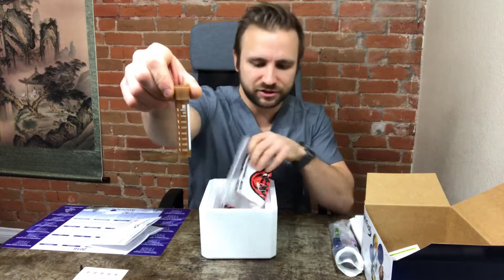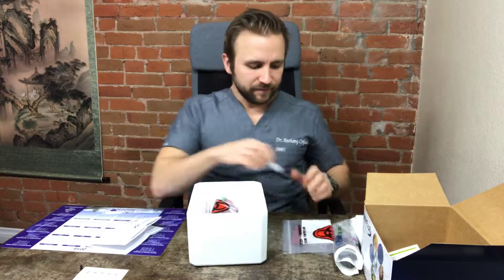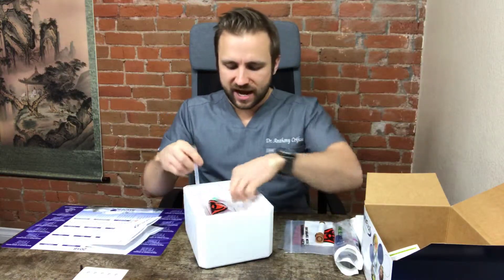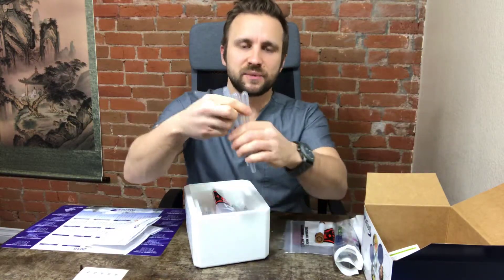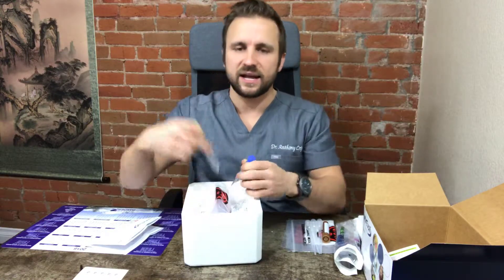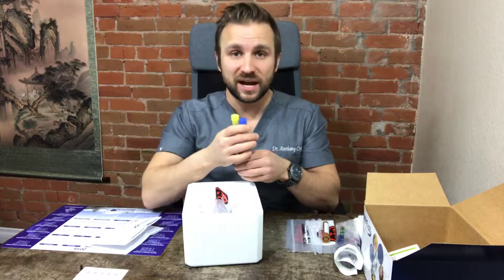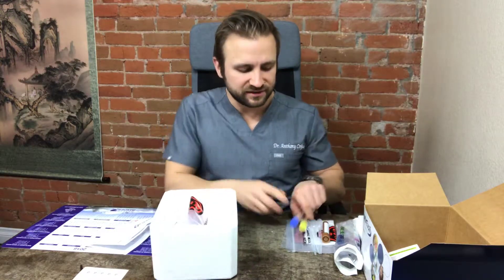You're also going to have a light brown tube, again for blood, and an empty bag with just an absorbent pad. You'll also have three pipettes and a yellow tube and a blue tube. Again, you do not need these for your purpose of the test, so just keep those to the side.